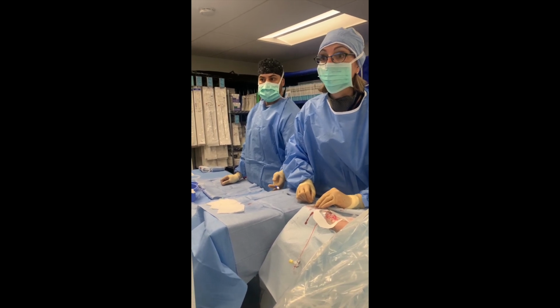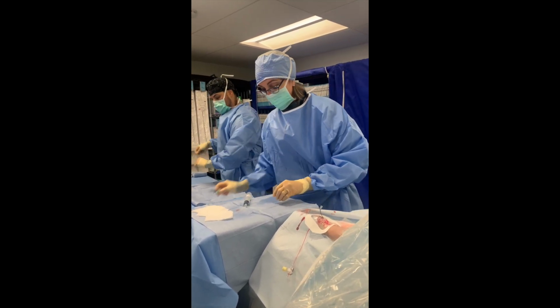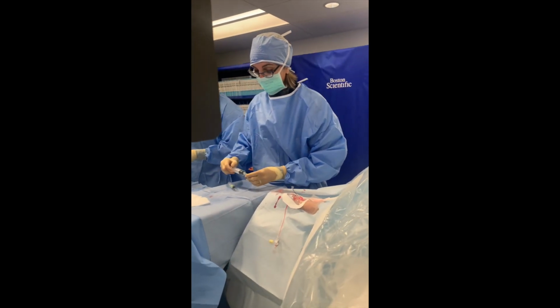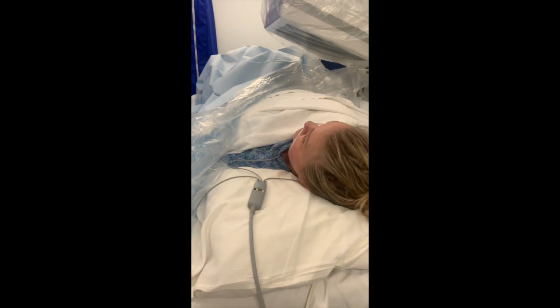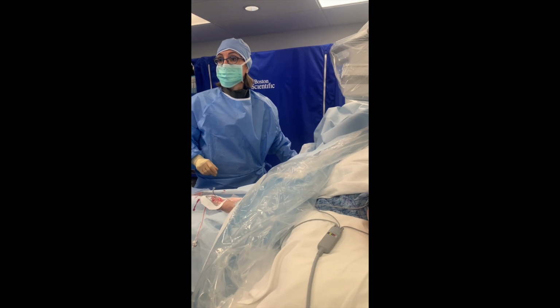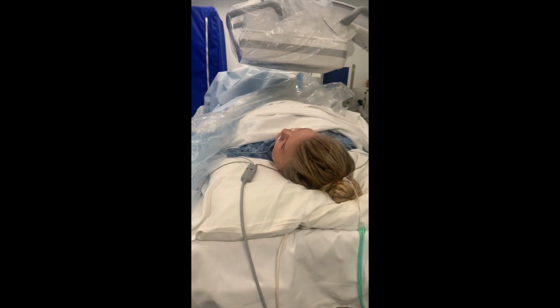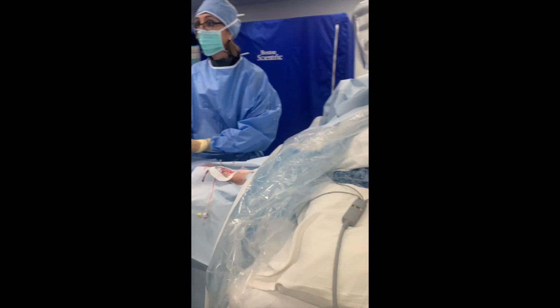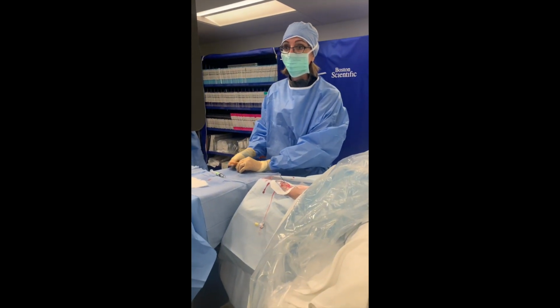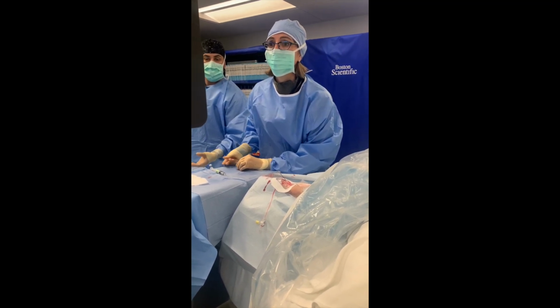So we're already in the right uterine artery. 2.5 minutes of flow time, wire out. Which is so great. Now we're going to go to an anterior posterior position and do a run. Always confirm. I'm going to want to advance this just a little more heavily. You want to shoot and see how far? For refluxing purposes, it's better to be around the first loop. Sometimes the microcatheter gets too many twists. I feel like the embolic doesn't go through it quite as well.